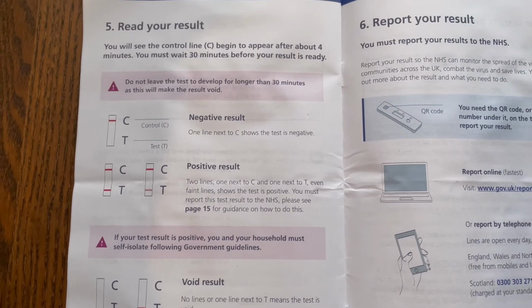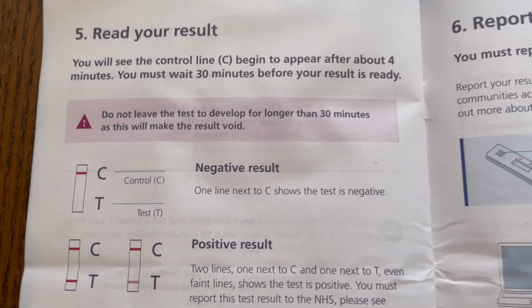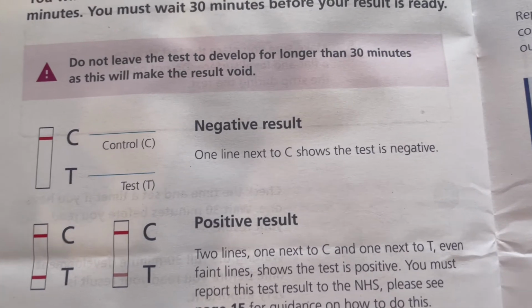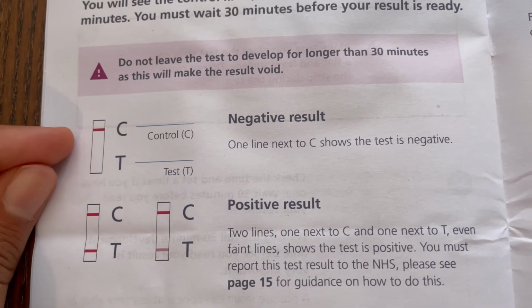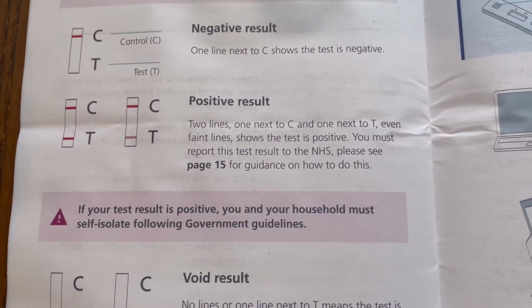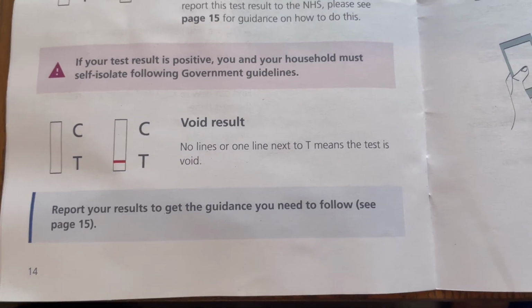This page is all about how to read your result. You must wait 30 minutes for your result to be ready. So the first result that you can get is a negative result. And the marker has 2 lines, and that is control and test. If there's a line in control, that means negative result. If it has any 2 lines, that means you are positive. If it is void, it will not have any lines, or it will have a line on the T.